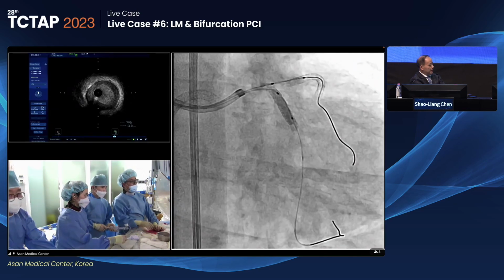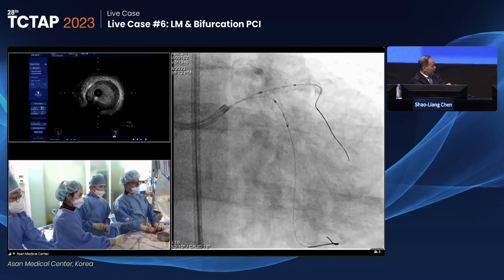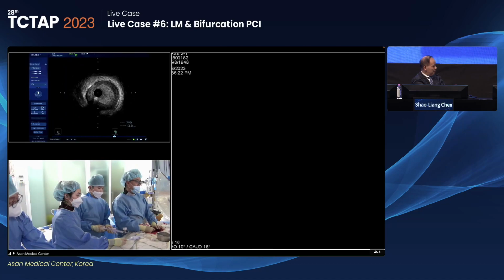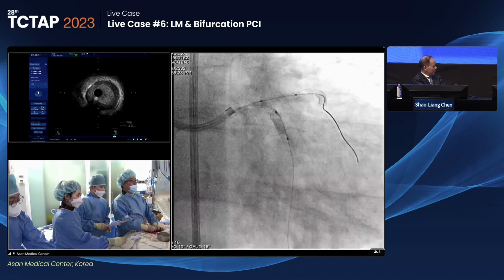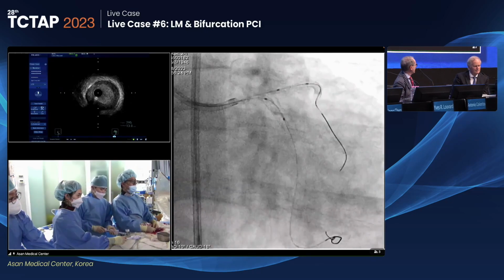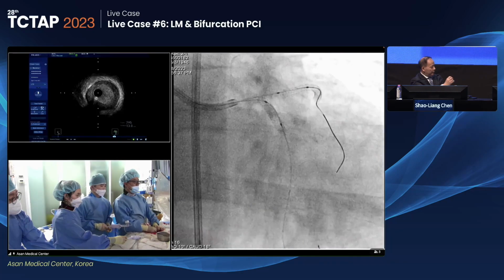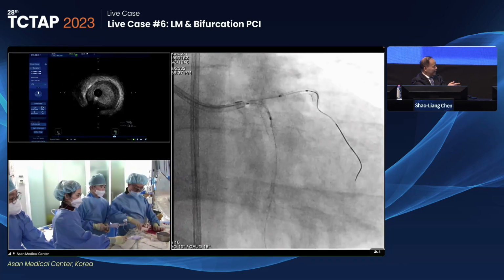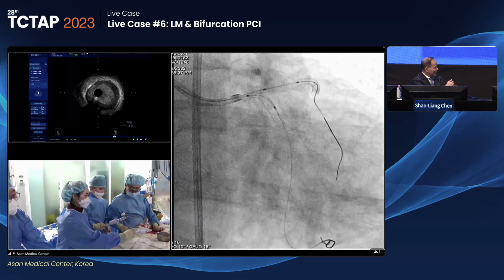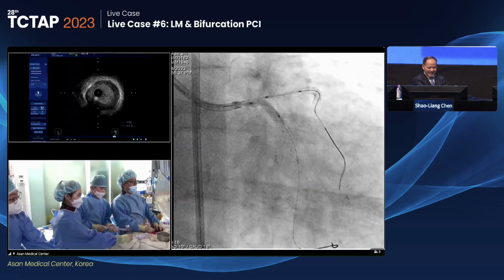One bifurcation DCB randomized trial is ongoing. Next year we will have 1-year follow-up results. For this trial, DCB will be used after stenting. After stent, yeah, because the problem is that after you stent, you may have deterioration of the side branch. So you really need to use DCB when you know that the result is good. Right. After stenting the main vessel, post-dilation, and rewire, very well pre-dilation. Again, pre-dilation of the side branch. But one concern is about the loss of the drug on the DCB. Yeah, right. We need a study for that.